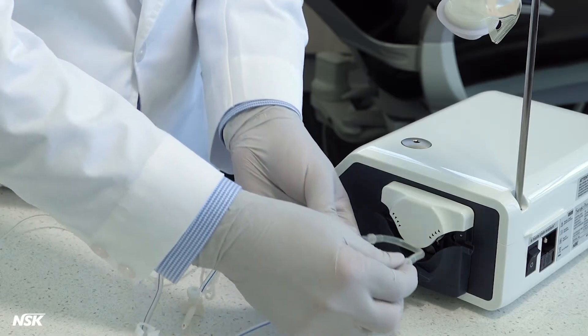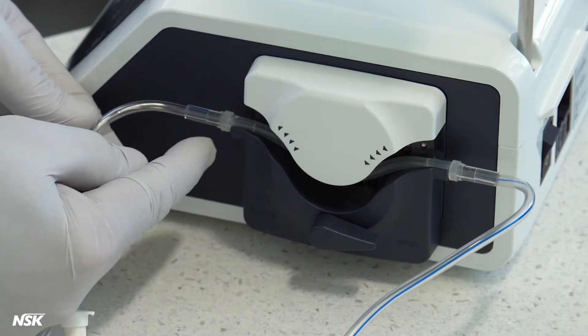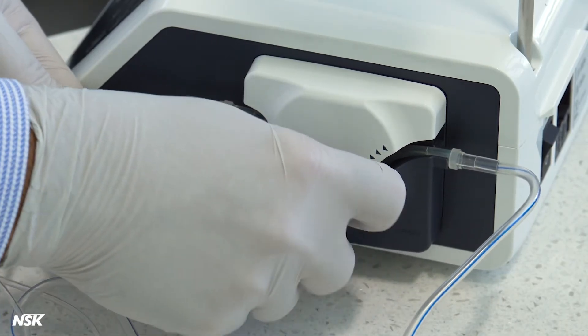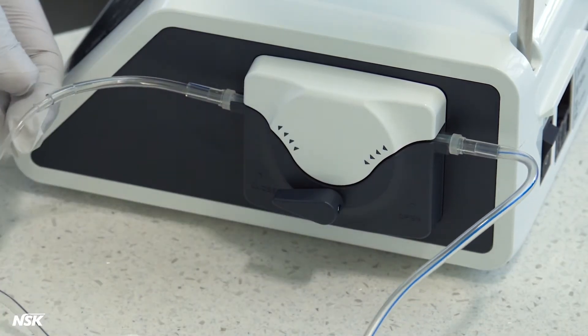Then, bend the tubing and insert inside the spindle. Make sure the two stoppers on the tubing stay outside the pump. Then, turn the lever back to close.